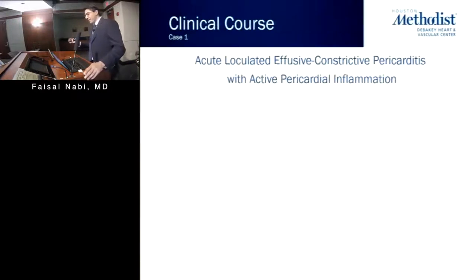So, at this time, based on the imaging that we produced with CMR, I think our diagnosis may have changed a little bit to now where we would say, really correctly, that this patient has an acute, loculated, effusive-constrictive pericarditis with active pericardial inflammation.